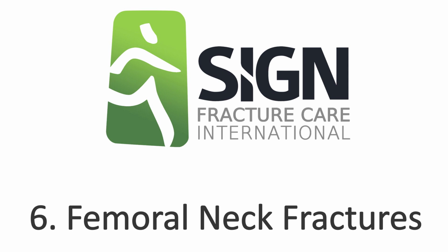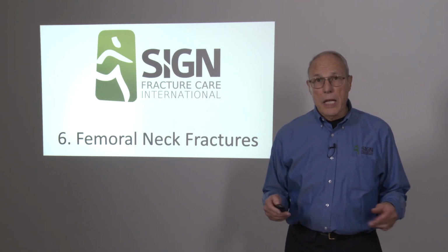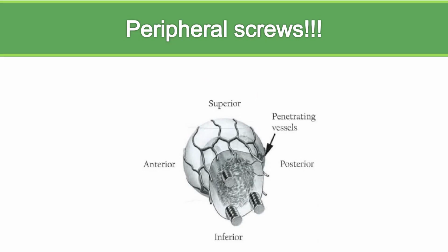Femoral neck fractures are also an increasing problem. They're different in developing countries because most femoral neck fractures are due to high energy motorcycle trauma. When you put the screws in, be sure they are peripheral. In many instances, the femoral neck in an older person is hollow. So if you go peripherally, you'll have better fixation of your screws.